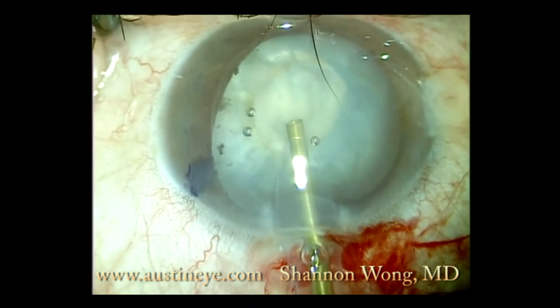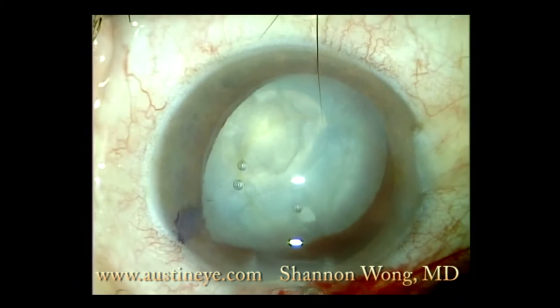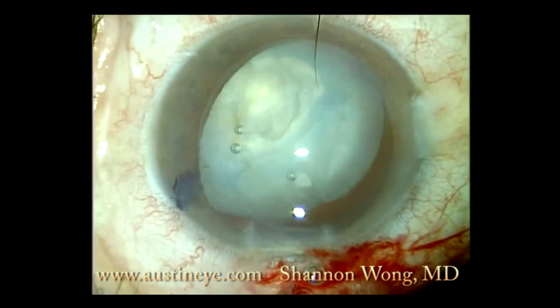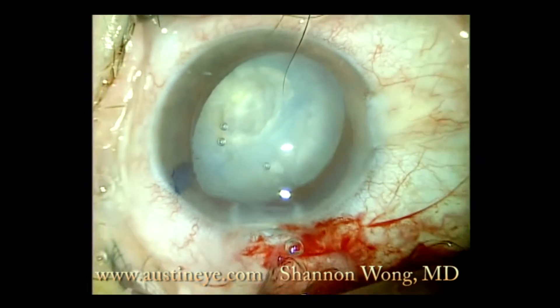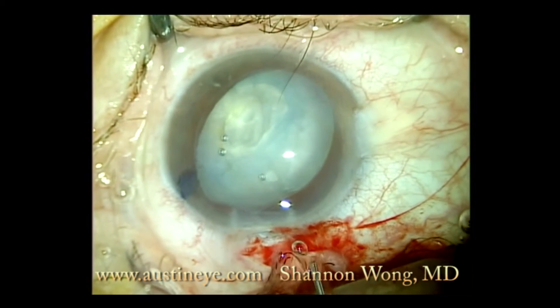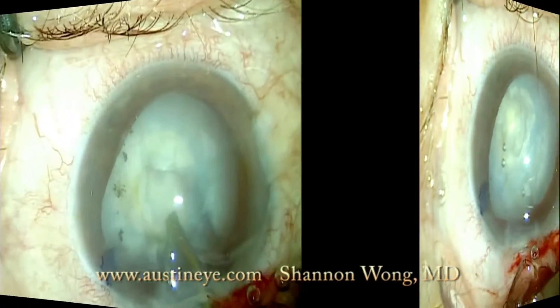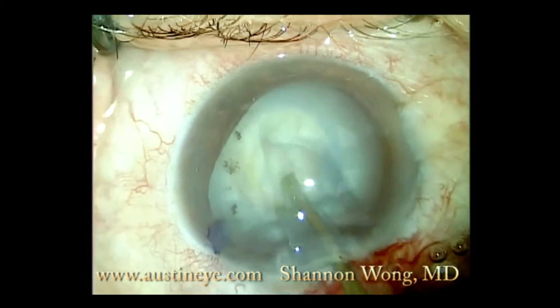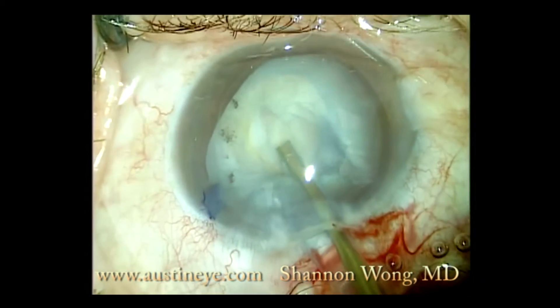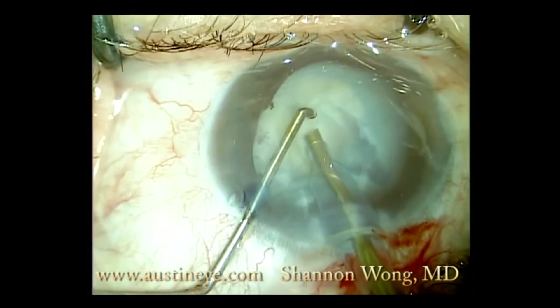When we started doing the phacoemulsification part of the procedure, we saw in a more obvious fashion the loss of zonules for what looks like about 4 clock hours. You can see it on this image from about 2:30 to about 6:30.